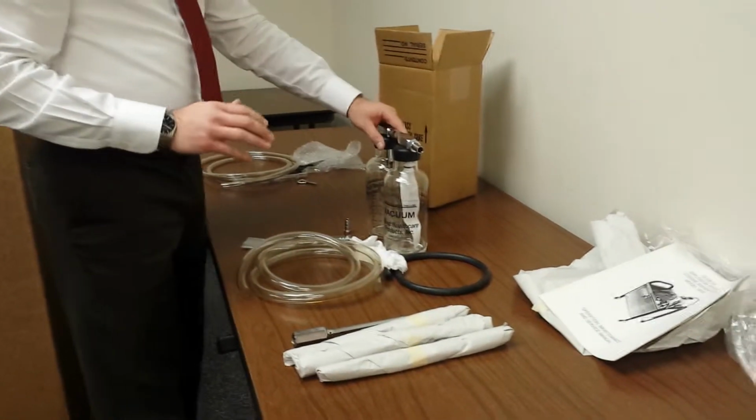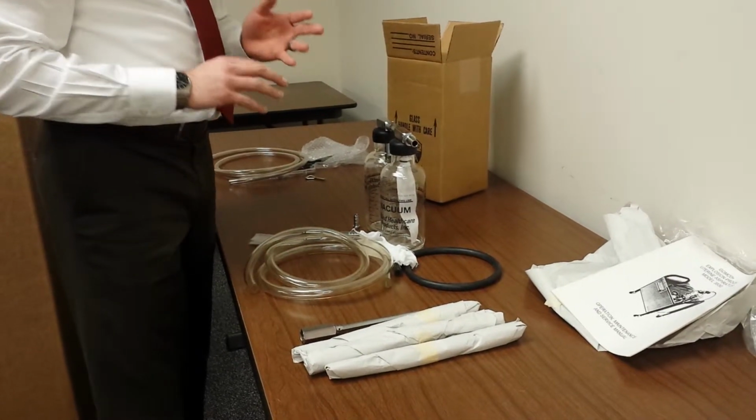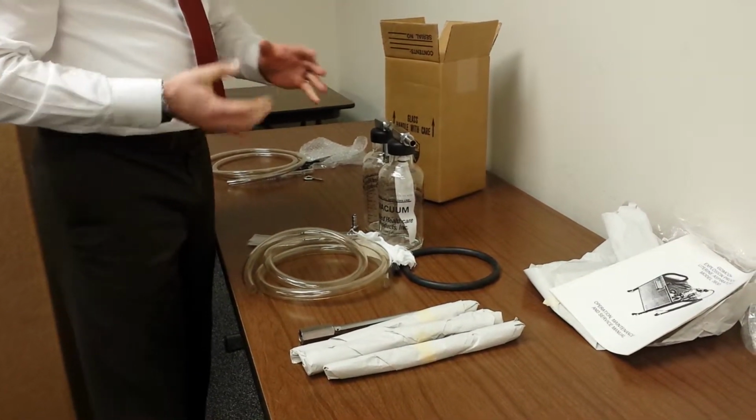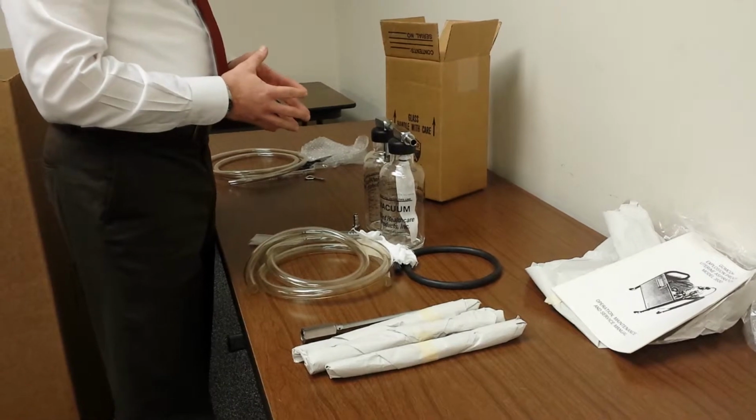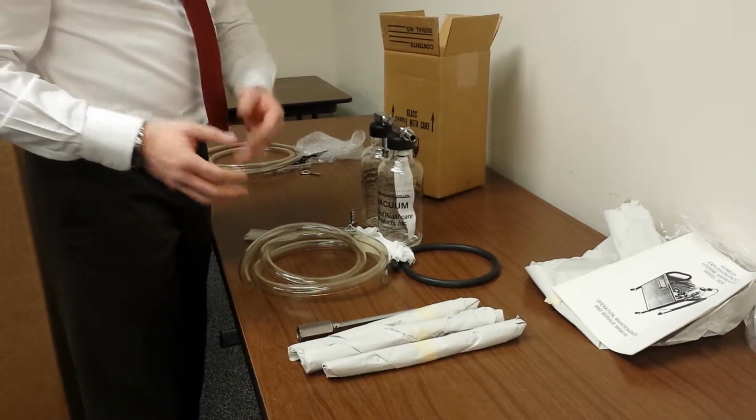Now, this assembly comes shipped from the factory as an autoclavable reusable assembly. So I'm going to show you how to hook that up first, and then I'm going to go into how to modify it if you want to use a disposable curette assembly.